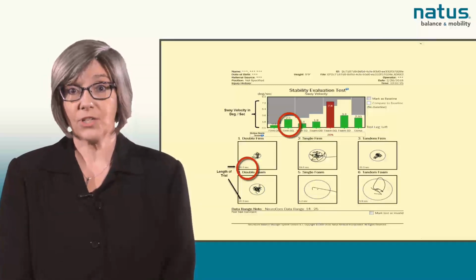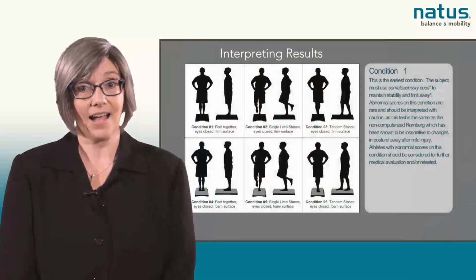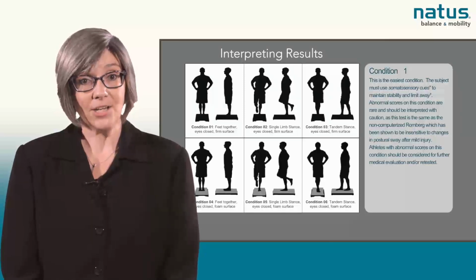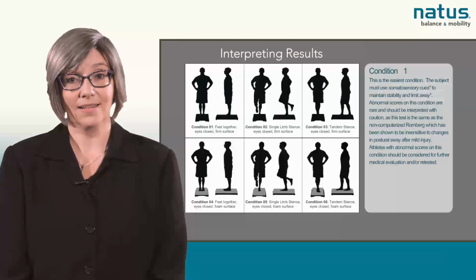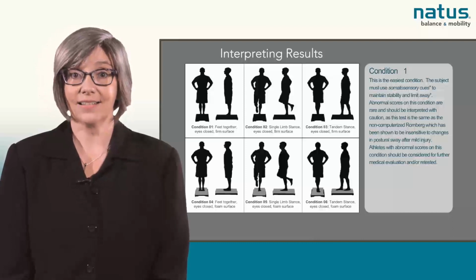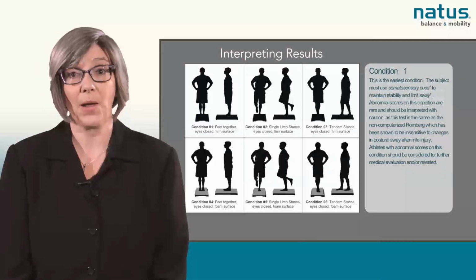What are the parameters for each of the 6 conditions? In condition 1, the patient is standing on a firm surface, eyes closed, hands on hips, with feet together. This is the easiest condition. The patient must use somatosensory cues to maintain stability and limit sway. Abnormal scores on this condition are rare and should be interpreted with caution, as this test is the same as the non-computerized Romberg, which has been shown to be insensitive to changes in postural sway after mild injury.